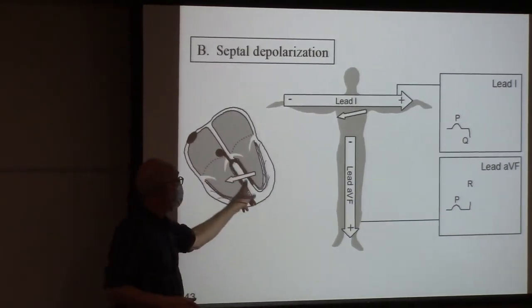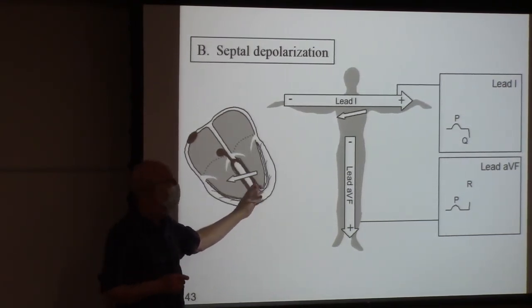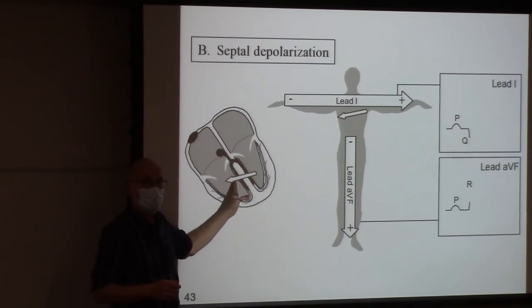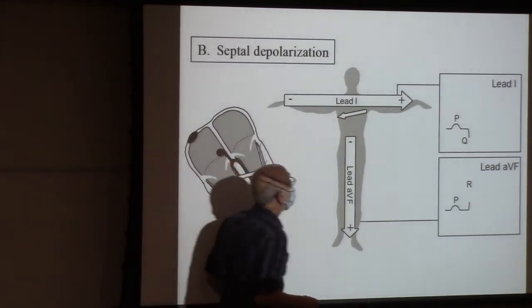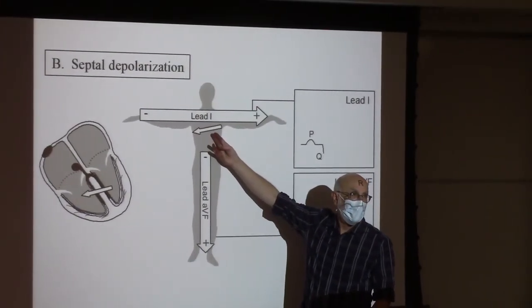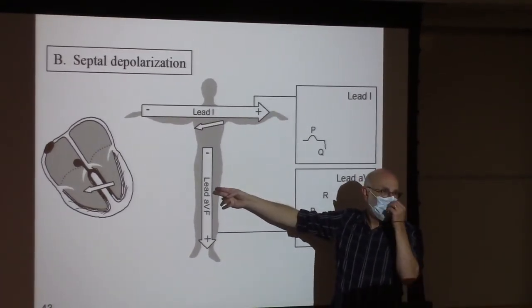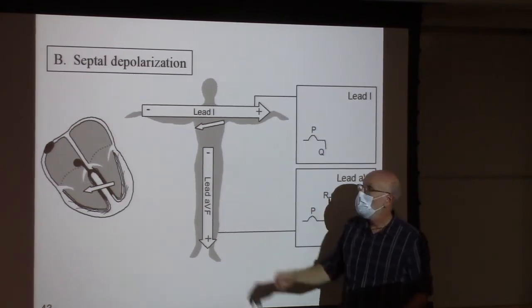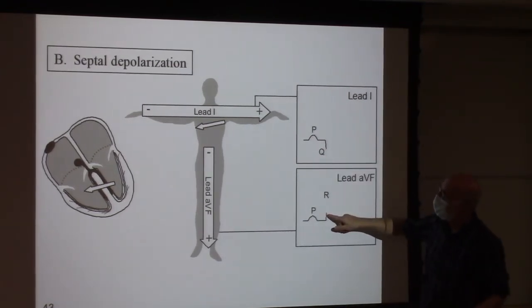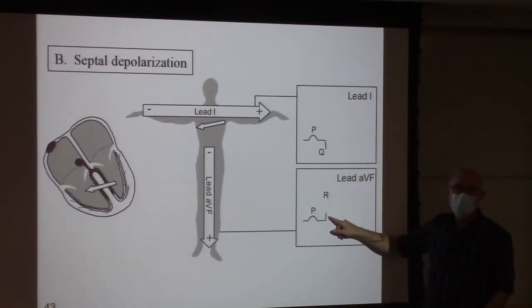The depolarization in the muscle is the big signal, not the Purkinje fibers. Purkinje fibers are small, septum muscle is big. The septum muscle depolarizes from left to right. Technicality, but it's an interesting technicality because it generates a vector like that: negative in lead 1, maybe almost hard to detect in lead AVF. So negative in lead 1, small positive in lead AVF.